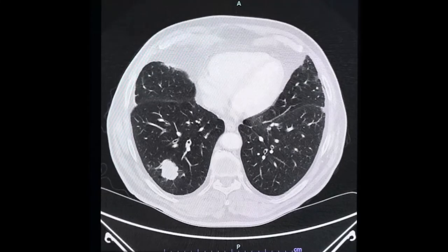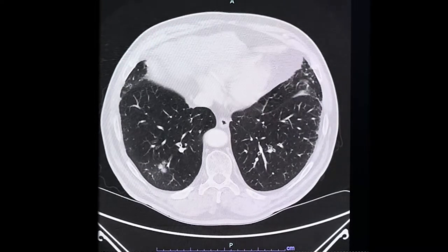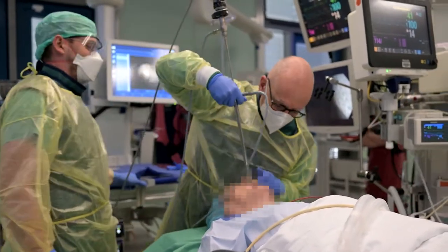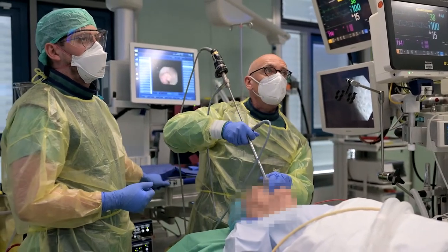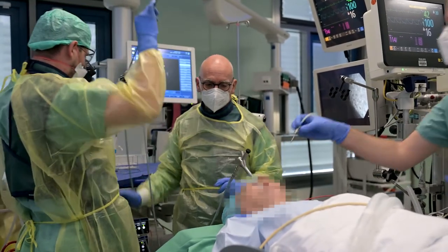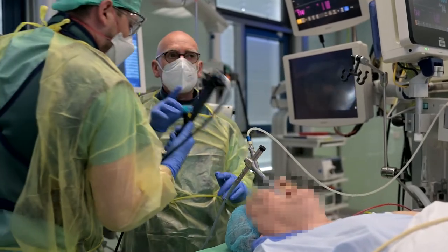Professor Hart demonstrates his approach to nodule biopsy on a patient with a solid lesion in the right lower lobe suspected of malignancy. After induction of general anesthesia and sufficient pre-oxygenation, the patient is brought into a supine position. Following slight reclination of the head, the 30-degree scope with the tracheoscope slid over its shaft is used for direct visualization of the glottis and entry into the trachea. The tracheoscope remains inside the lumen while the rigid 30-degree scope is removed.